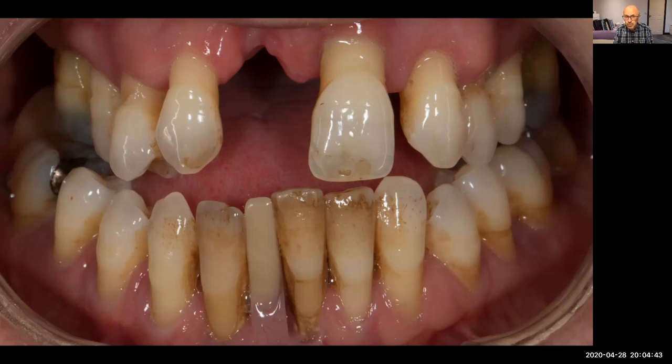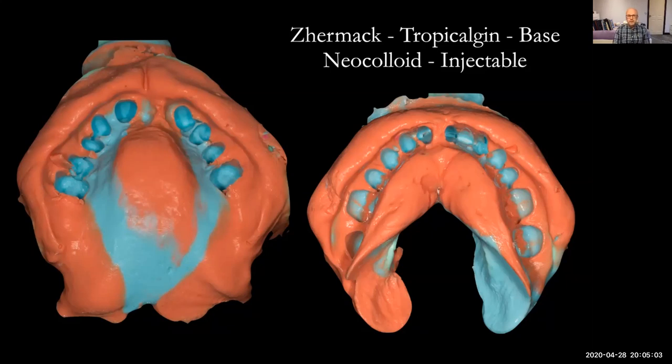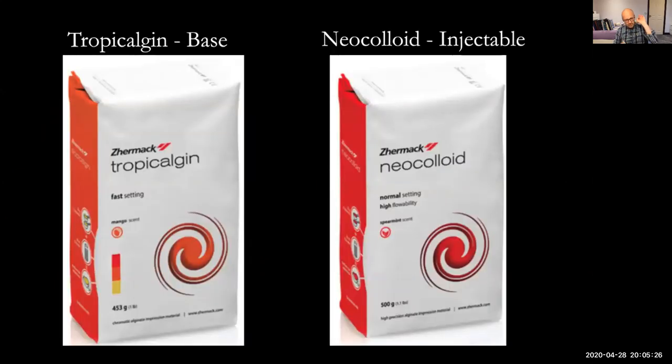Now, my job at this point is to give Rowan some superb impressions of the mouth on which he can then cast a model and then produce a superb denture. So let's have a look at the impressions that I did for her. Now, if you've been watching the webinar series, you'll know that I really love, for primary impressions, this 2-part technique where we have a runny material, a light-bodied alginate, which I squirt into the sulcus, and then a base material which is placed in the tray. So, and this is the key to superb dentures. And this is the material that I like to use. So the base material is Alginate, and the runny injectable material is neocolloid.